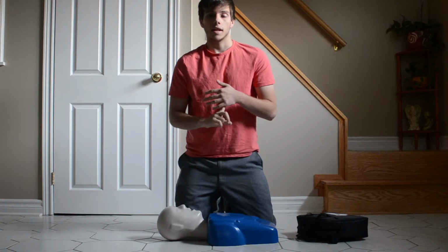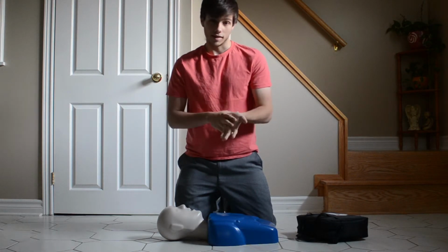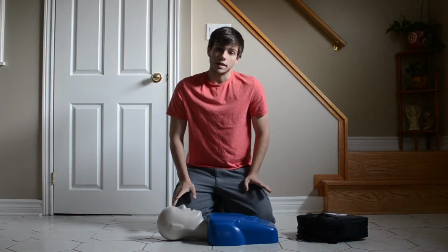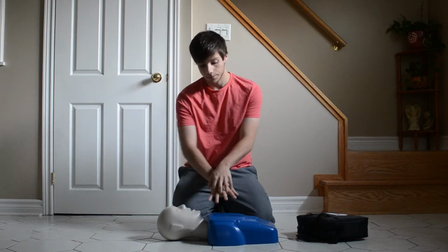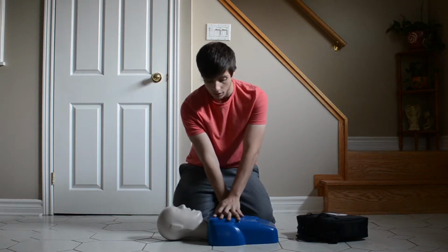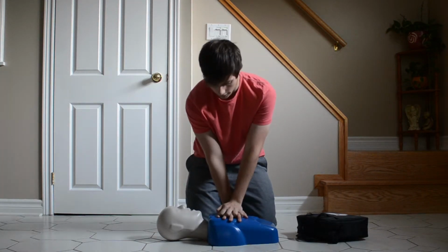It scans the heart with 2 pads. It works sort of like a very basic ECG. So as I get somebody to get an AED and call 911, I'm going to start CPR. So go to the nipple line, go to the center of the chest, and I'm going to start the CPR. I'm going to do 30 compressions and then 2 breaths.